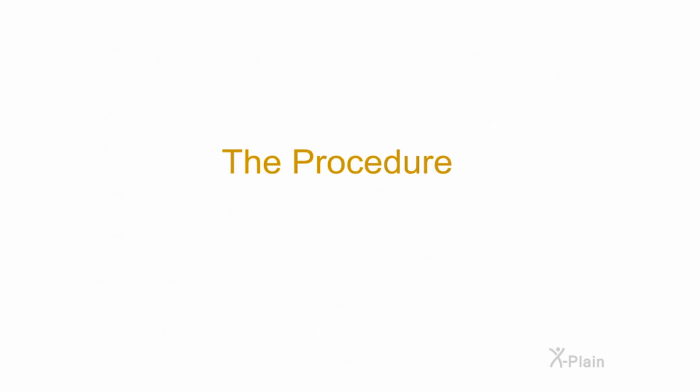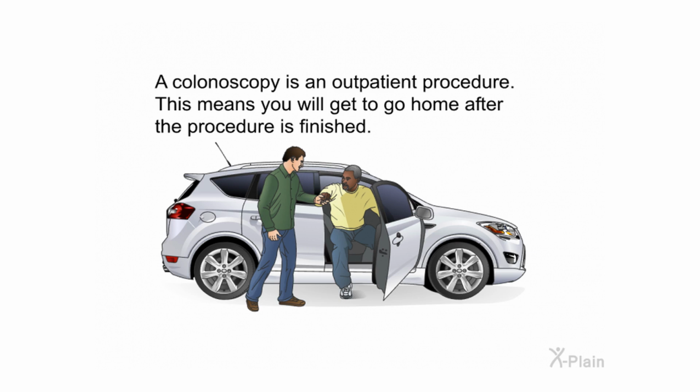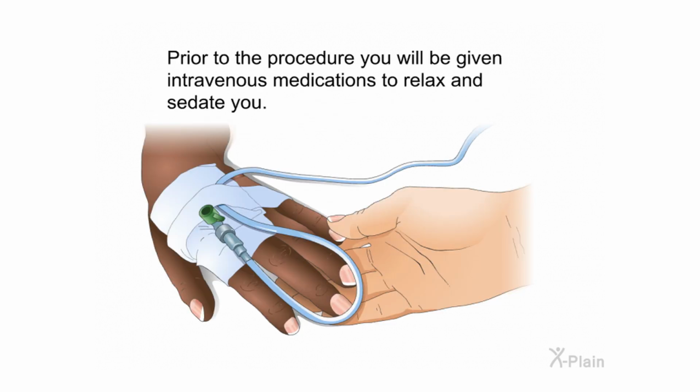The procedure. A colonoscopy is an outpatient procedure. This means you will get to go home after the procedure is finished. Prior to the procedure, you will be given intravenous medications to relax and sedate you.